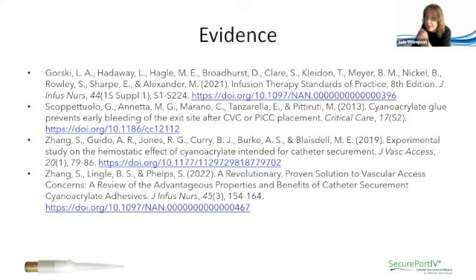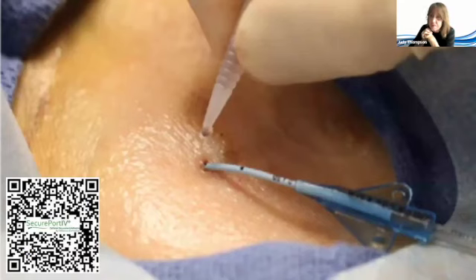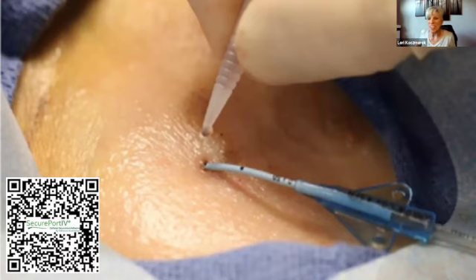Lori, I have a question for you. Yep. So I was in a conversation with a good friend, colleague, just yesterday, and we were talking about the buildup of, let's say every dressing change, you continue to put tissue adhesive over the site. Does it build up on the catheter or does it slough like it does with the skin? It does both. The tissue adhesive releases off the skin as skin cells are naturally regenerating, and that generally starts about day 5 to 7 after application. And that's why reapplication is recommended when you're doing your routine dressing change.